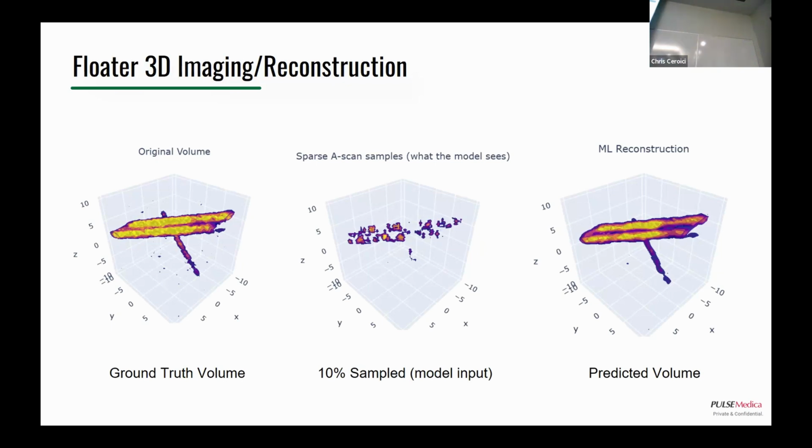You might, but if you look at this string here in your sparsely sampled input, you only have one small chunk. So to build a treatment plan, what that might look like is a spiral of treatment points that follows the geometry of each floater. Same thing here, another pattern of points that looks like that. So you need to know the bounds of that floater, the actual morphology. Yeah, we use that term a lot.